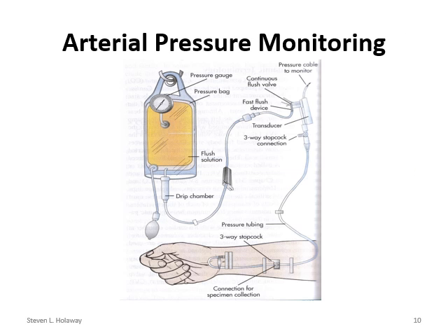Now, the rest of any type of pressure monitoring system consists of a transducer. This transducer is basically a device that converts mechanical energy, the pulsations and pressures coming through the arterial line, into a signal that is then sent through a cable up to your monitor so that we can see the waveforms going across and tell how well it's functioning.